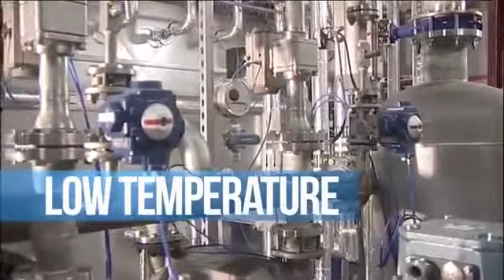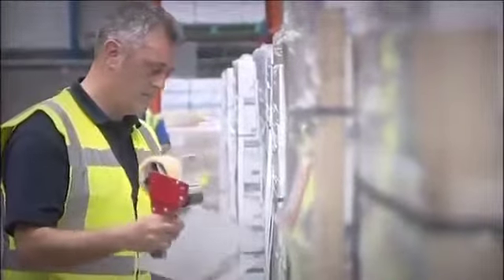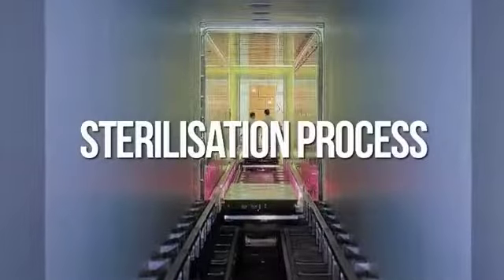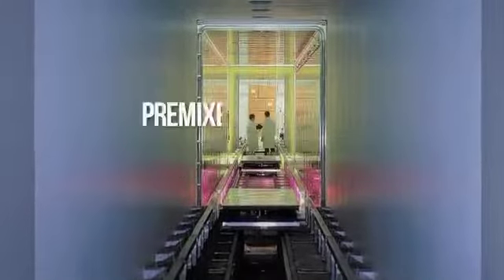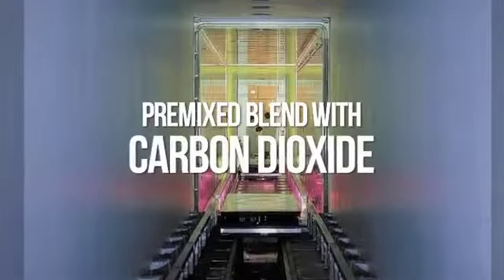As a low temperature sterilisation method, typically between 40 to 50 degrees, the process does not have a negative impact on the form and function of the medical devices themselves, making it very suitable for a wide range of medical devices. The sterilisation process is carried out using either 100% ethylene oxide or with a pre-mixed blend of ethylene oxide and an inert gas such as carbon dioxide.